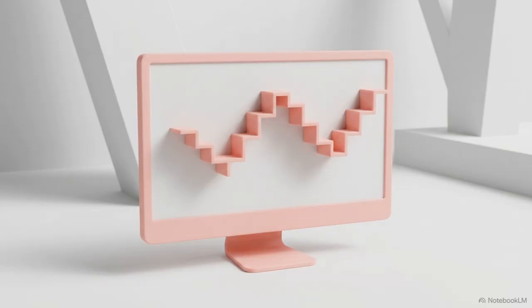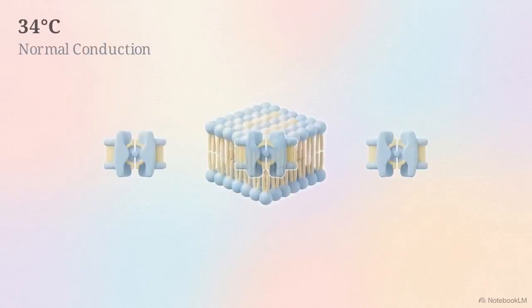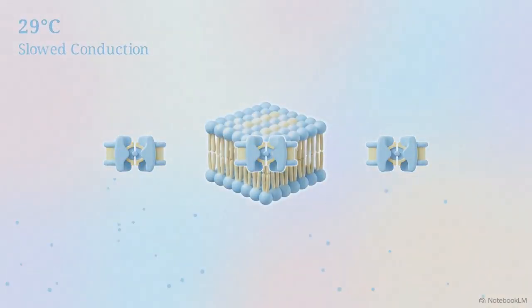Even with precise anatomical mapping, electrodiagnostic testing remains highly susceptible to environmental artifacts that create physiological illusions. The most common technical error in the EMG laboratory is performing a nerve conduction study on a cold limb. Low tissue temperatures alter ion channel function and slow acetylcholine esterase activity. This biological reaction artificially drops the nerve's conduction velocity.